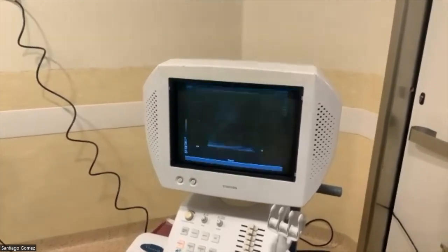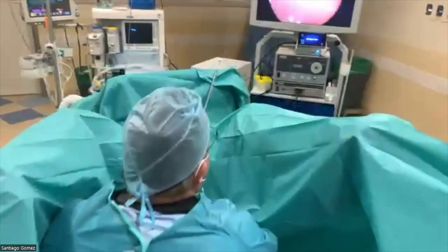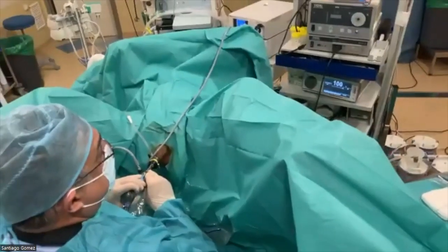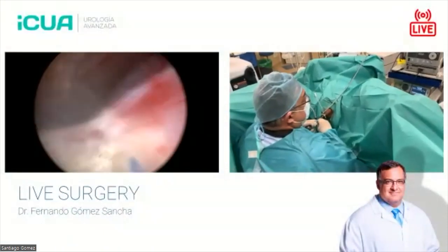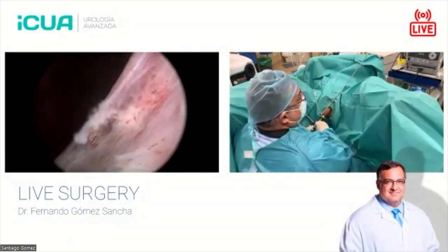the anatomical job was very good. There we go. And now we will switch to morcellation. Let's do the final check. These bleeders are the ones that can bother you a lot with morcellation if you don't spend the time to coagulate. So Marek, is there any other question or aspect you want to cover?